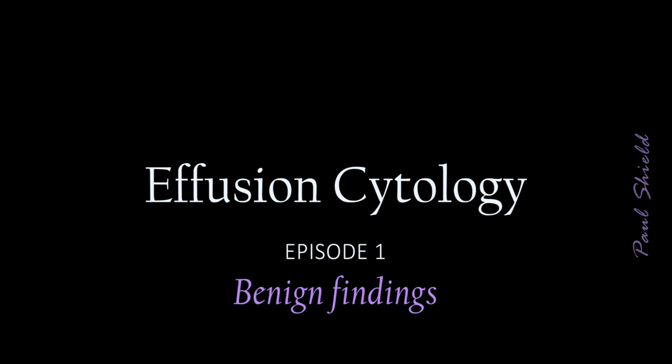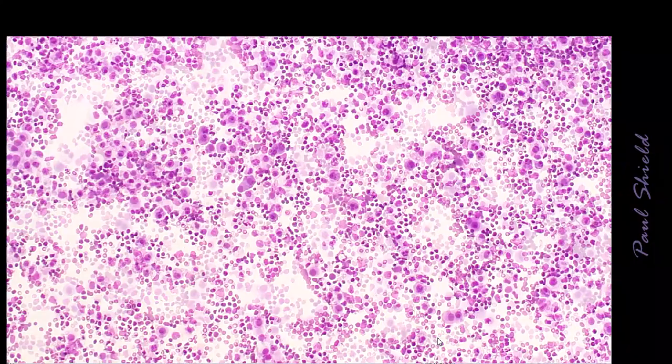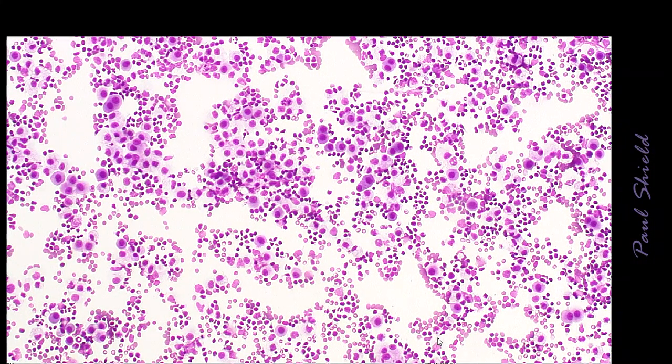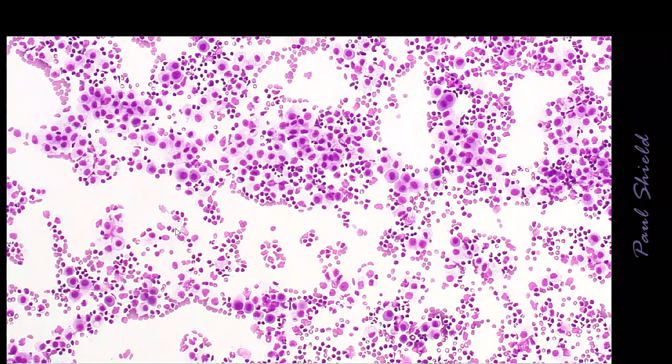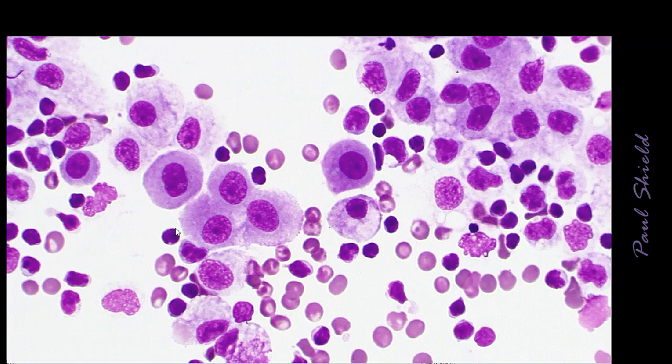Now I'm going to concentrate on the morphology of mesothelial cells because that's the key, I think, to diagnosing fluids. Here is a normal fluid specimen. We've got quite a lot of leukocytes in the background, which will mainly probably be lymphocytes. And then scattered around we have cells with a lower NC ratio. These are mesothelial cells. You can see they're mostly single in arrangement with some little groupings, particularly pairs of cells.